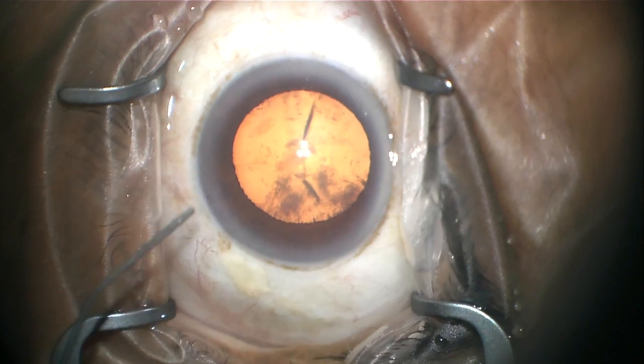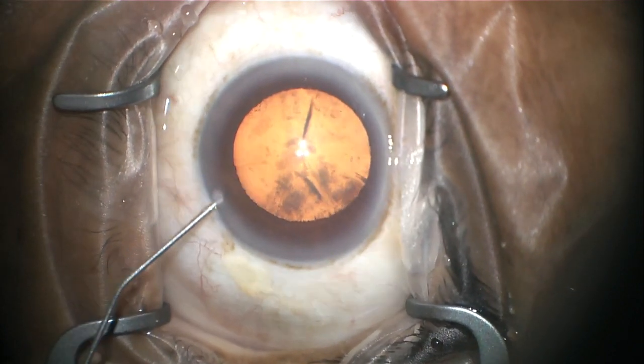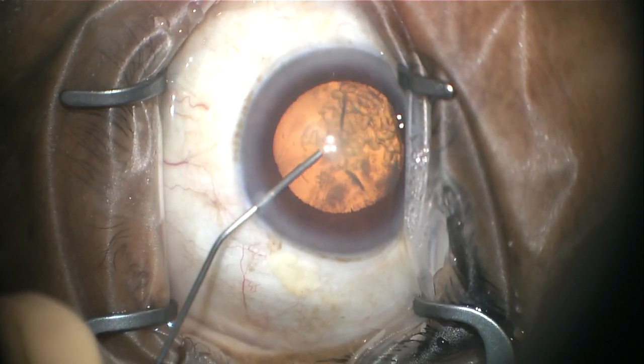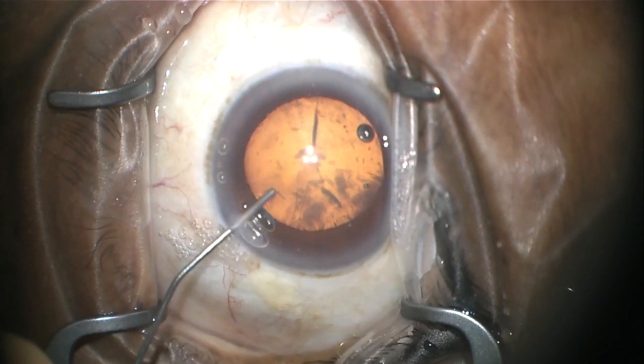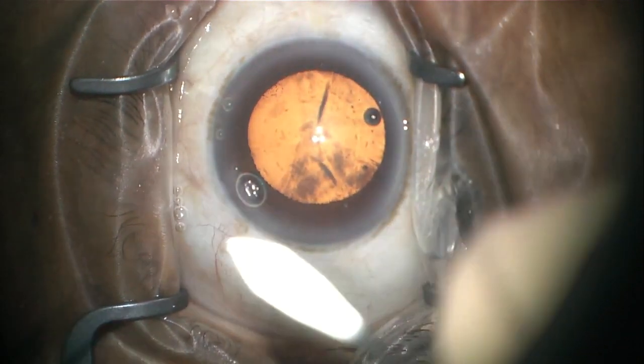A thick gel called viscoelastic is then injected through that little bitty incision. This viscoelastic provides protection to the inside structures of the eye while the cataract is being removed.